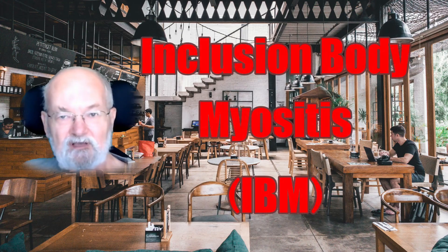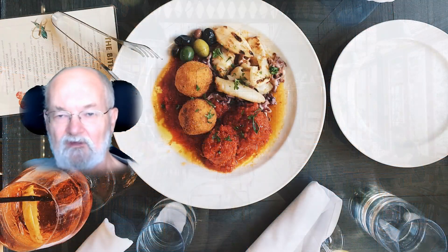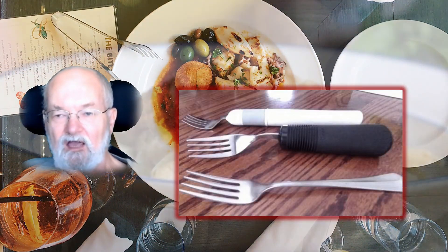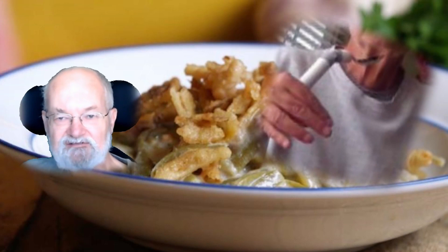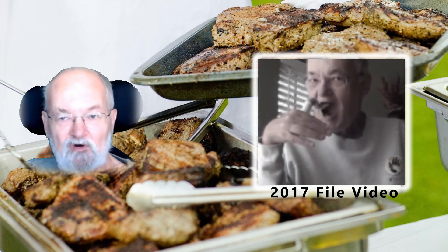Since my diagnosis of inclusion body myositis in 2007, I faced increasing challenges including the task of lifting food up to my mouth. After purchasing several eating instruments that had a short useful life for scooping food, I researched and invested in the Liftware Level — a computerized handle that keeps its attachment level for people with limited arm and mobility, resulting in helping us eat more easily.